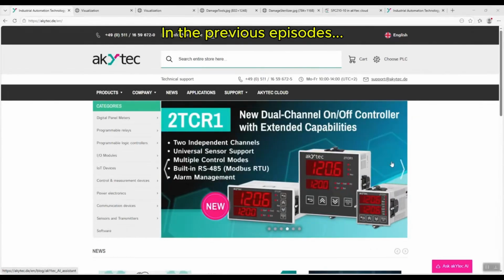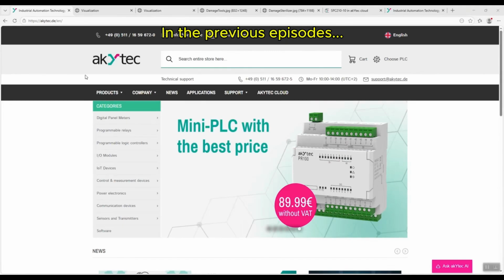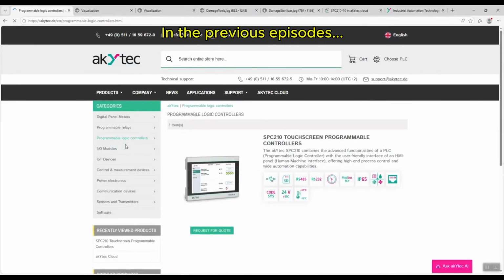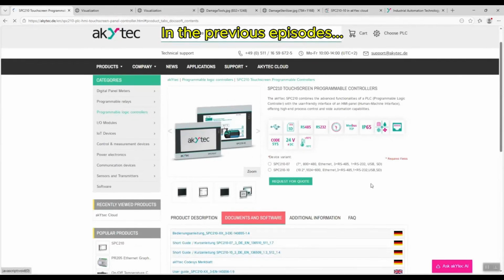How did we end up in the middle of the CODESYS project? To answer that question, let's go back to the very beginning. The first step is to download the necessary software. For this, let's go to the akYtec website. In the Products section, select Programmable Logic Controllers. Then choose the SPC210 Touch Programmable Controller. After that, go to the Documentation tab and select Software.